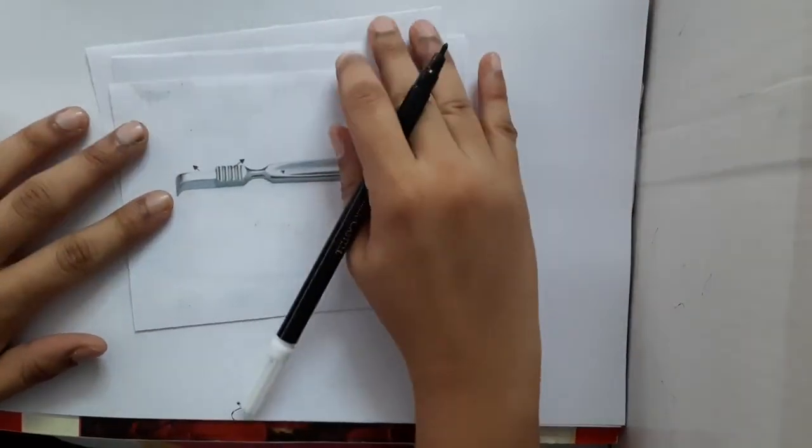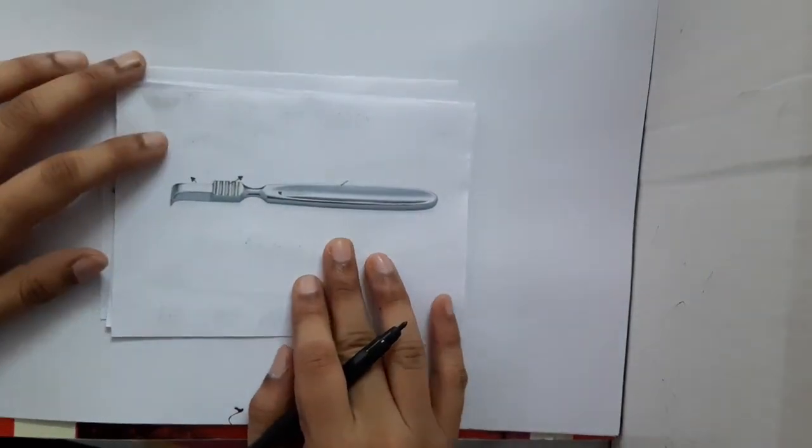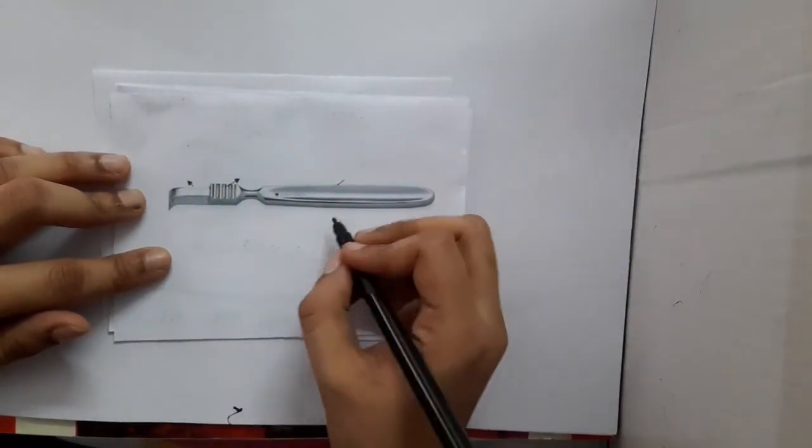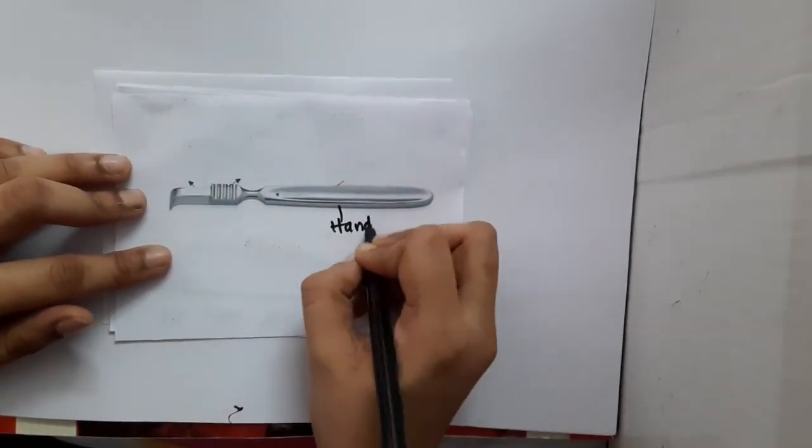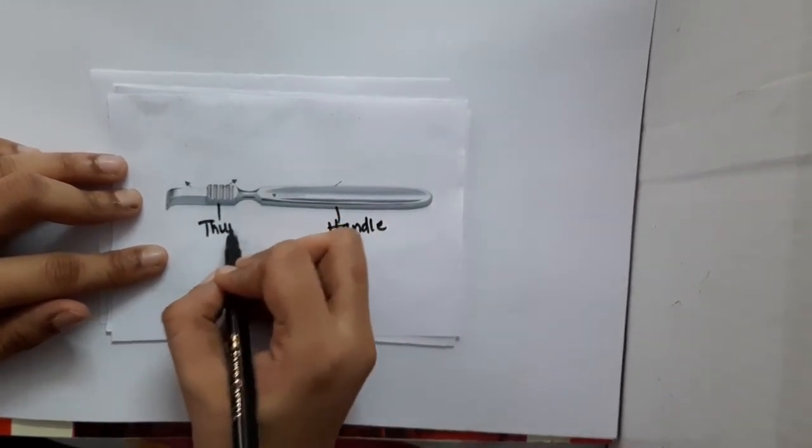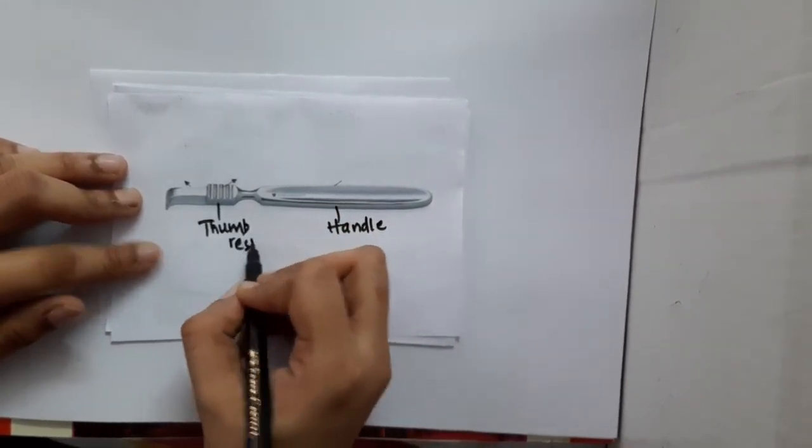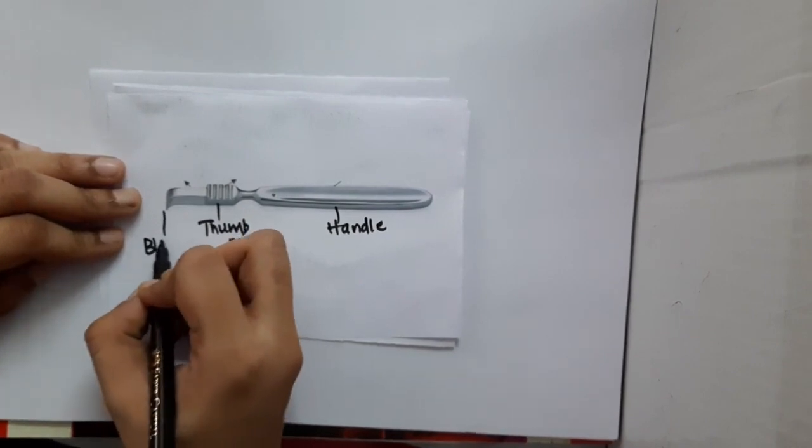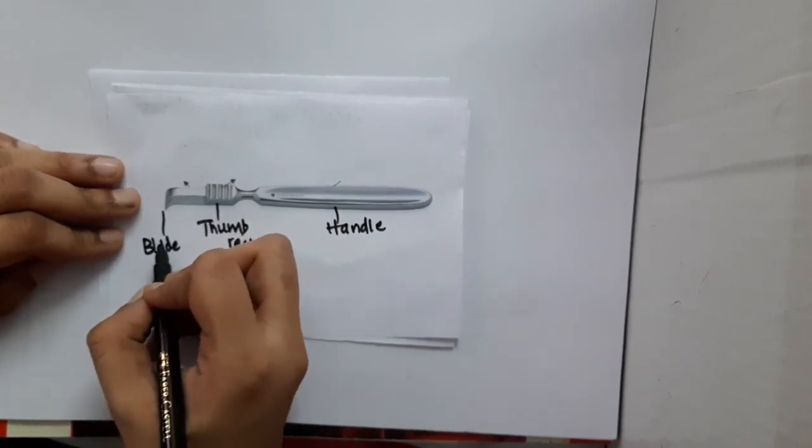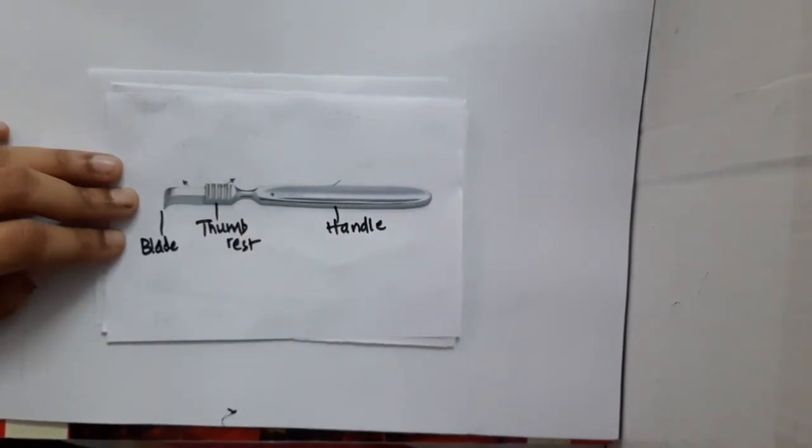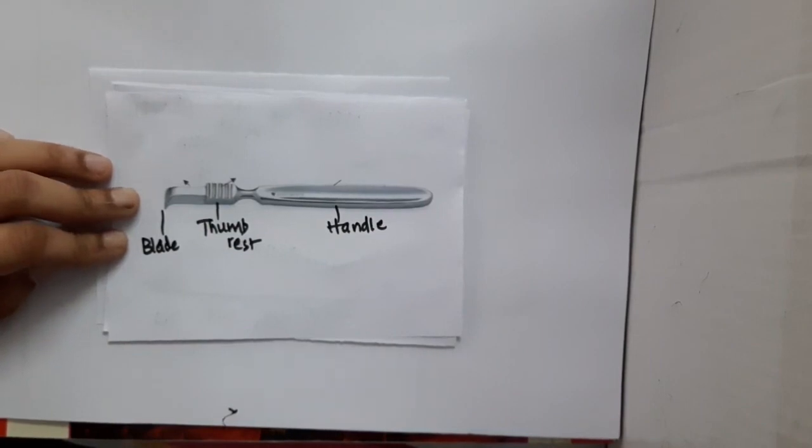See what does this have? This has a handle, this has a thumb rest, and then it has a blade. It has a handle, thumb rest, and blade.